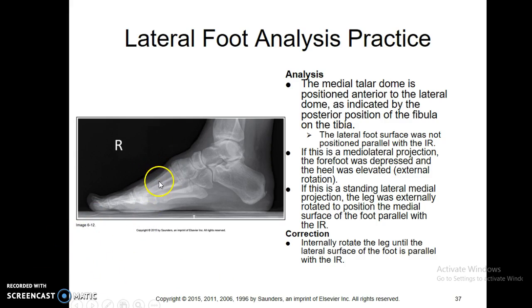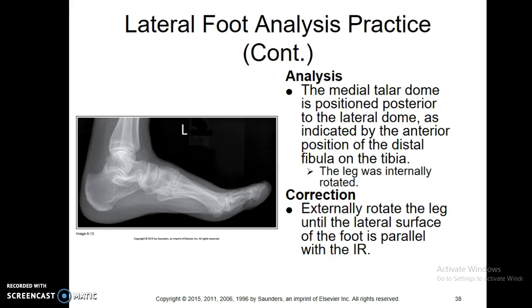This one's a bit rotated, like we just said. A lot of metatarsals separated, not quite on top of each other. The base of the fifth comes out really nice, so if they have base of the fifth problem, probably want to include this as well. We're going to look at this as well, so if you look at how far the fibula is coming down, it shouldn't come down that far. So make sure you kind of go over each one of these slides.